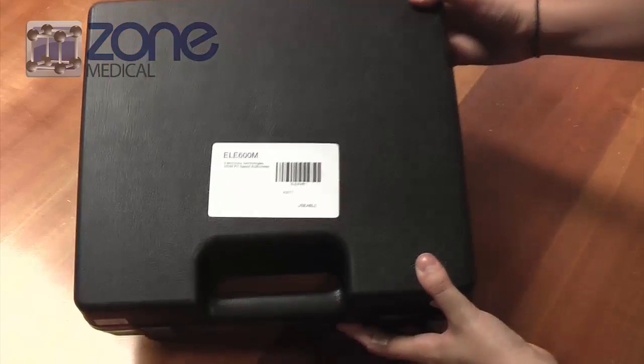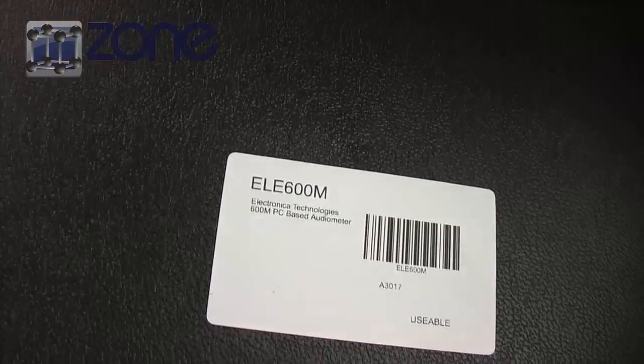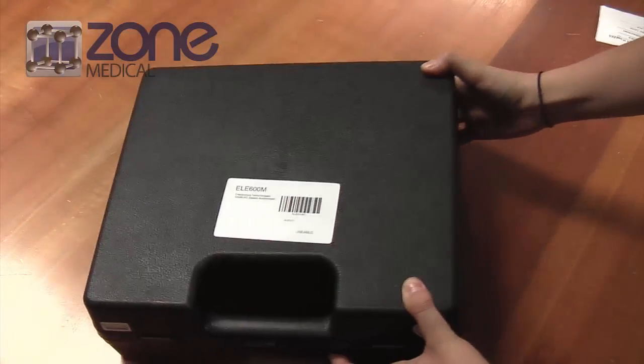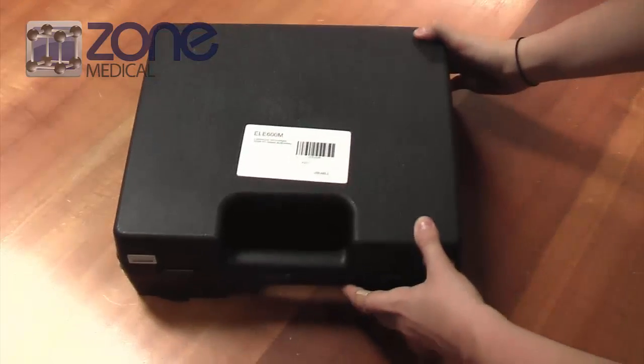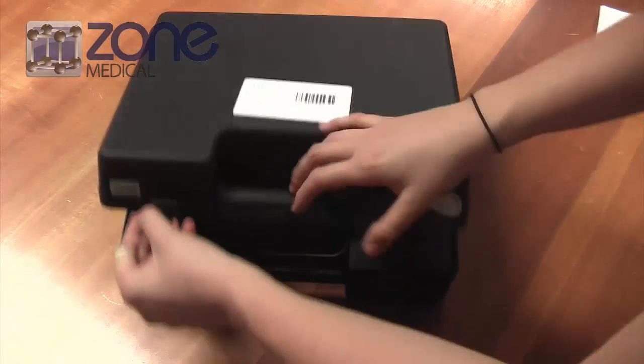Today I will be showing you the Electronica audiometer. This one comes in a black card case that holds the device and all of its components.